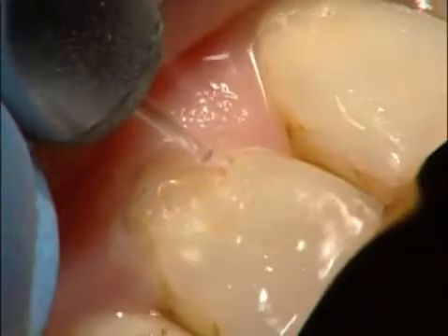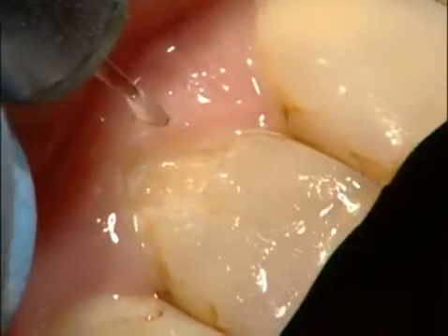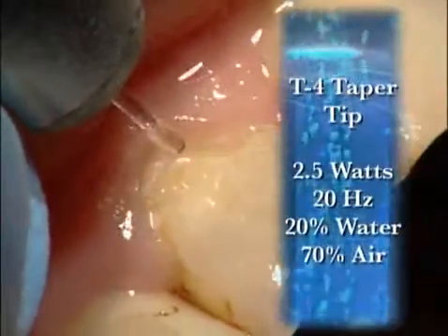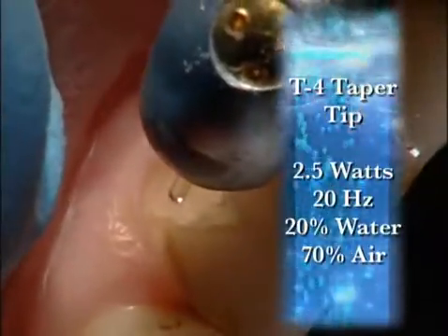When I want to put retention in, I'll use the T4 taper tip, usually at 2.5 watts, 20% water, 70% air at 20 hertz.